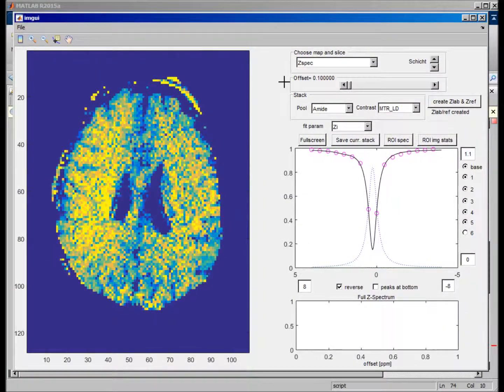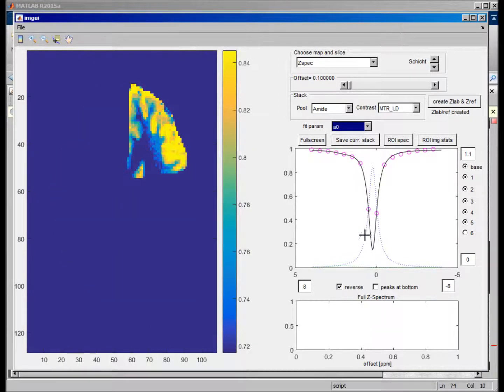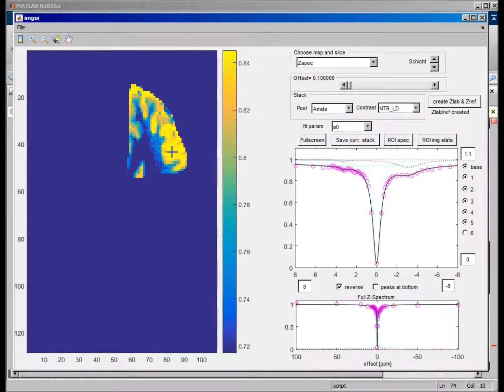And there we go already. These optimal parameters are given here. That's the initial magnetization and then the different Lorentzian parameters. For example, let's first have a look at the water line. This would be the peak of the water line, and we see it's not so deep in the white matter because of the broad MT. Therefore it's dark here, and it's brighter in the gray matter region.